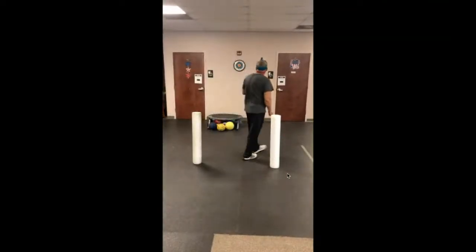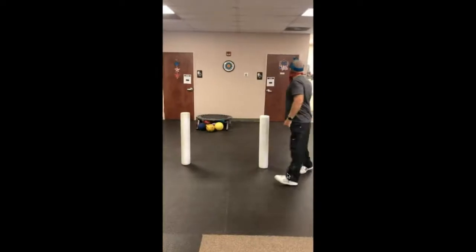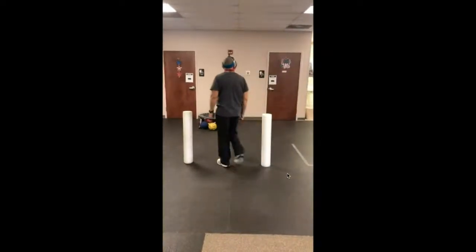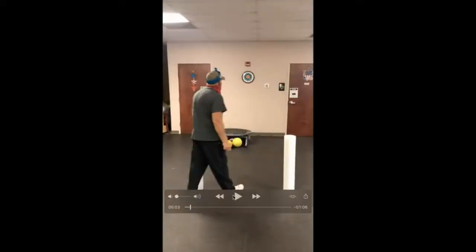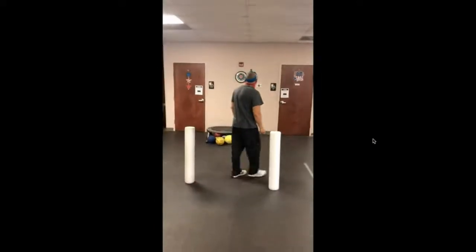Okay, you line that one up very quickly. Get your head faster around. There you go. Get that laser on the target as you come back through. So if we look through that again, we can start maybe here.